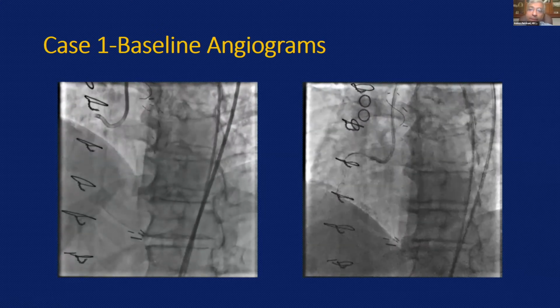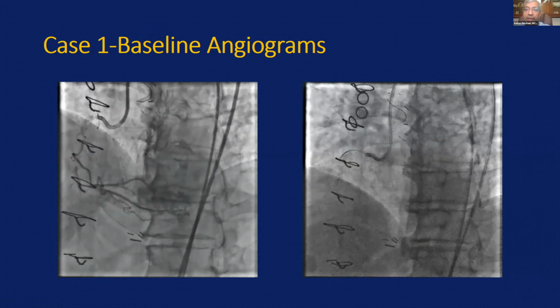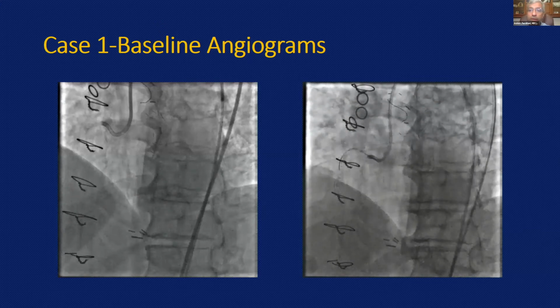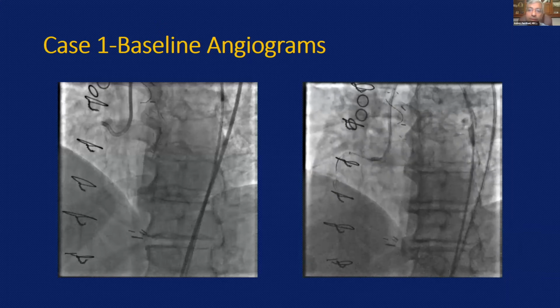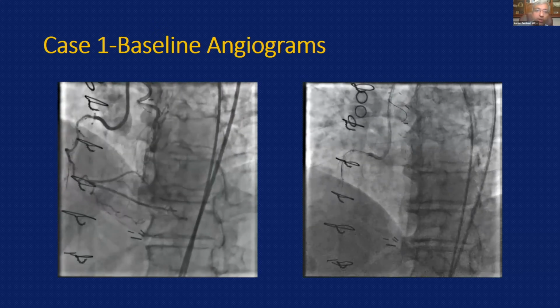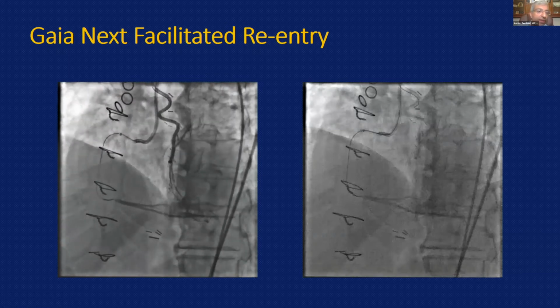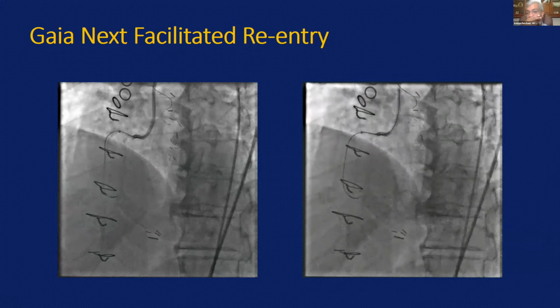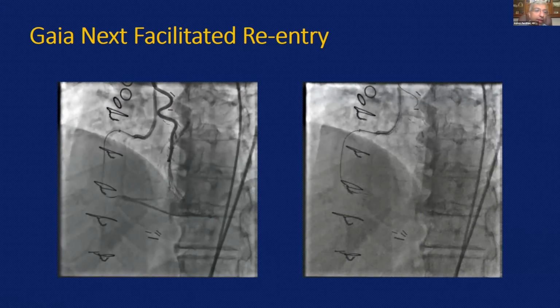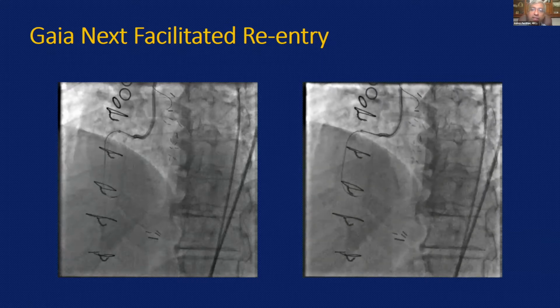Yeah. So on the right panel, we obviously use the LIMA for visualization, and here you have your AL guide, and I went straight ahead with a game plan to get past this whole ambiguity and long segment with a knuckle. And you can see that the knuckle very rapidly brought us to the distal cap. Here I was sitting at the distal cap, really close to the bifurcation. In the past, we would bring down a Miracle 12 and a Stingray and contemplate use of a really advanced stick and swap maneuver.